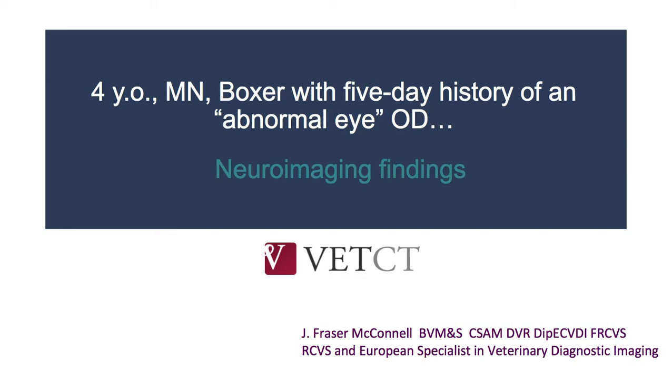Hello everyone, and we've got another great case this week from Elsa. This is the 4-year-old male neutered boxer with a 5-day history of an abnormal eye. We'll have a look at the MRI and see what that showed.